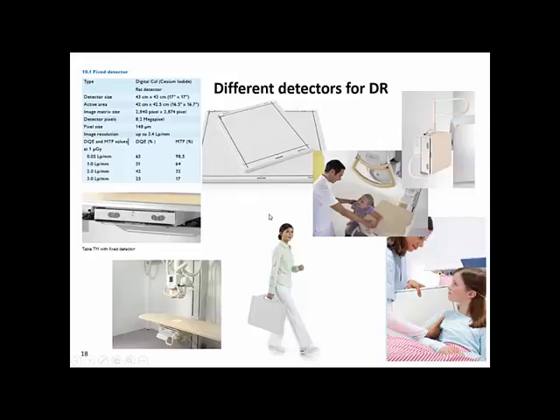All these detectors have a certain amount of technical data, of which I would like to talk about some. Number 1 is the bit depth. We know that our detectors supply 14, 15 or 16 bit depending on the type. Now what does bit depth mean? It means how many gray levels for each pixel are supplied. Here is an example of only 8 bit. We see 256 gray levels. This is the equivalent for 8 bit. You see the image is quite decent already.